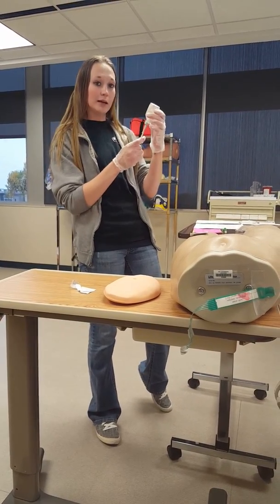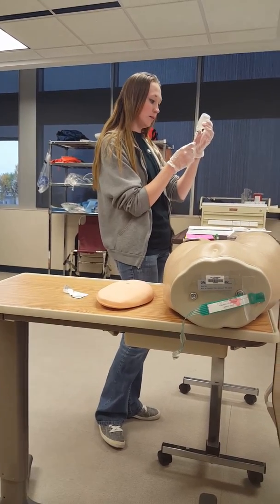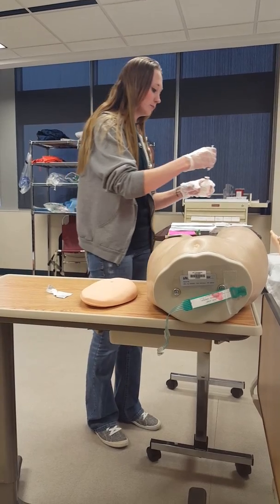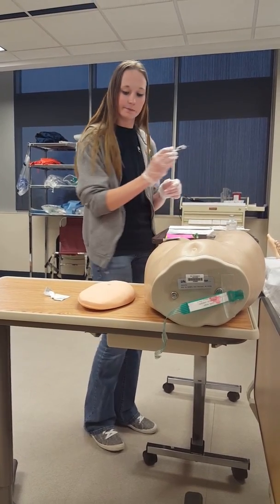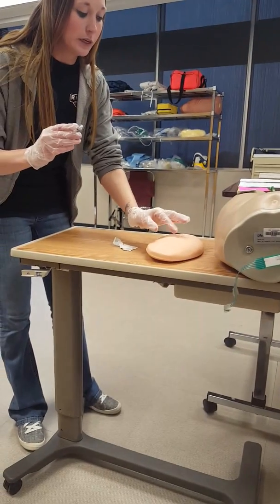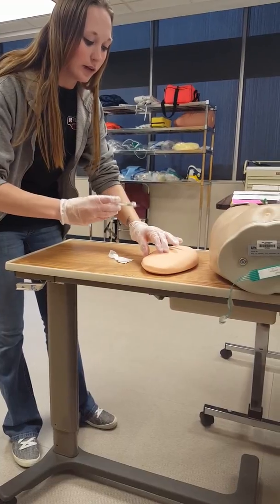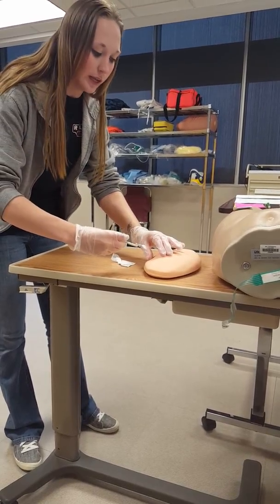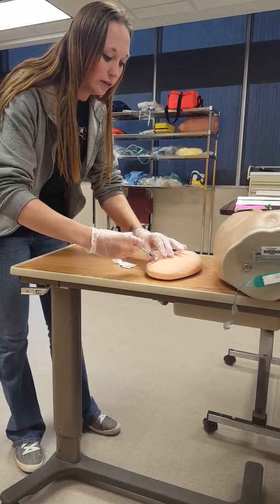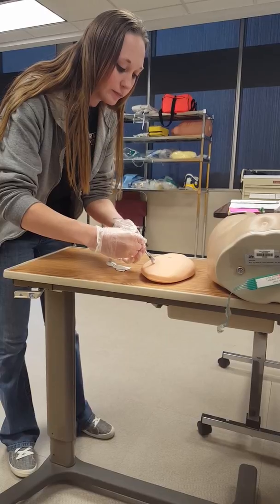Okay, and then I'm going to check my med against the MAR again, and Novolog, I'm giving 10 units, Novolog 10 units. Okay, and then, like I said before, I would make sure I'm 2 inches away, I would pinch the skin, and I'm going to do the 45-degree angle. And then I would push it all the way in.